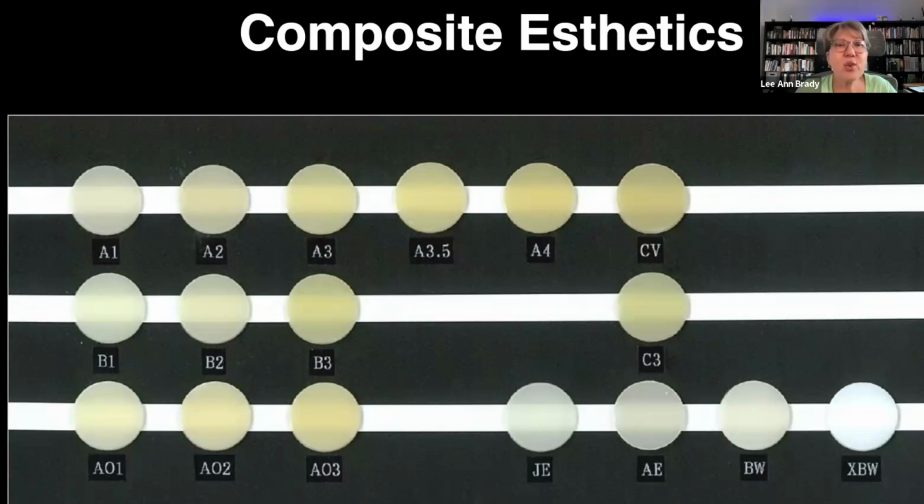Okay. Then you have your dentin shades in this system, and those have probably a similar opacity to the enamel shades in the Empress Direct. And then you have the 2 enamel shades. They call them JE and AE, juvenile enamel and adult enamel. And those probably have the relative translucency to opacity of the opal and the clear shades in the Empress Direct system.